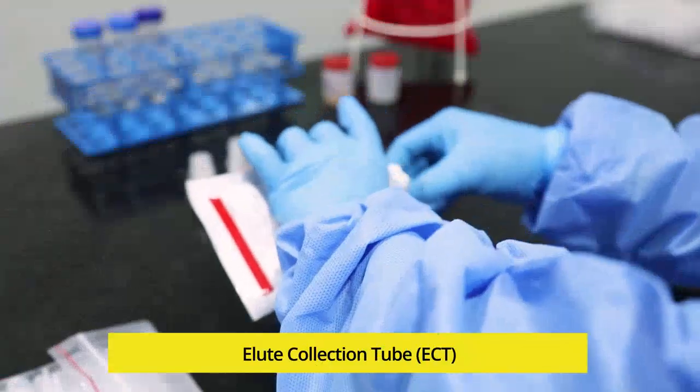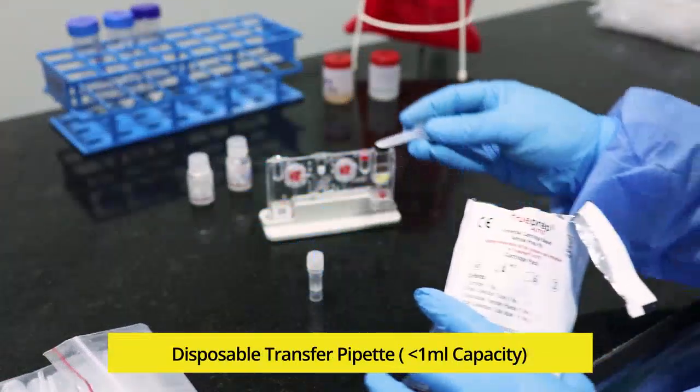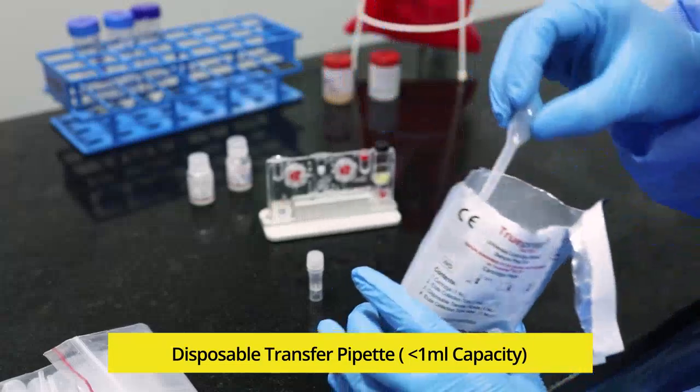Take out the elute collection tube and keep it aside for later use. Check if the transfer pipette is provided in the pouch, and keep it inside the pouch itself.